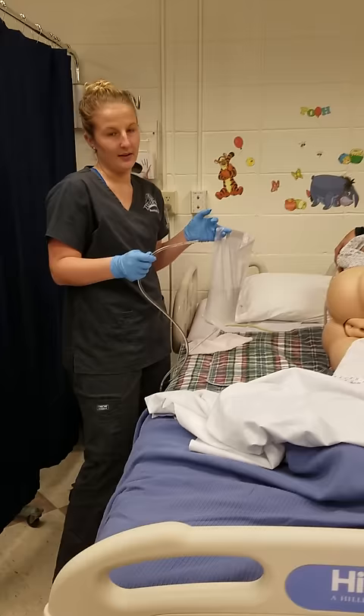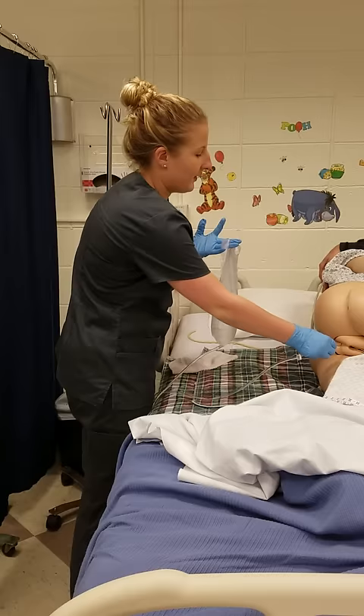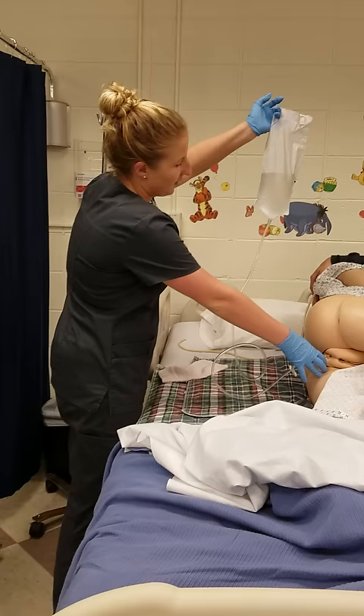I will hold it at their waist level and whenever they're ready I'll let them know that we're going to get started. I will insert it into their anus, and if it's getting too tight or they're not relaxing, I'll have them take a deep breath and I'll insert it three to four inches. I'll leave it in there and then I would unclamp the tube. As they could bear it, I would raise the bag 12 to 18 inches above their hip and hold it there until they could take as much as they could handle.